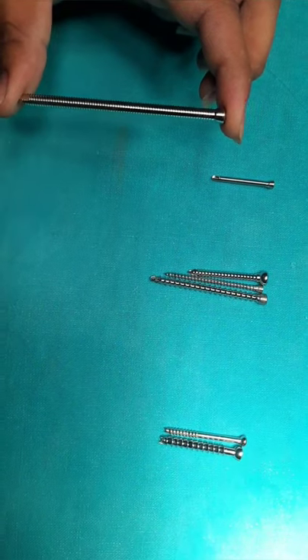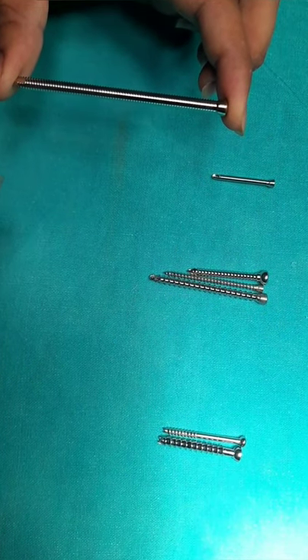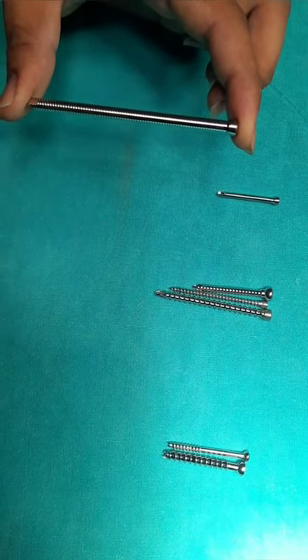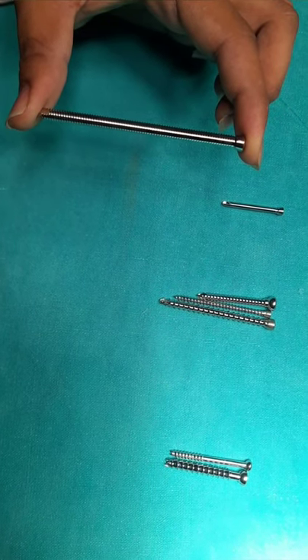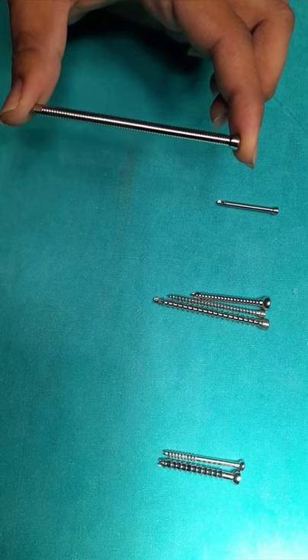1.5 mm cortical screws are used in phalanx fractures. 2.7 mm in metacarpal and phalanges, 3.5 mm in radius, ulna, fibula, and clavicle, and 4.5 mm in humerus, tibia, and femur.